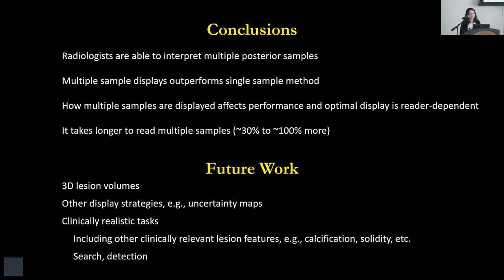We also plan to expand the study to more clinically realistic tasks. In addition to spiculation, there are other lung lesion features that are important for diagnosis, like calcification and solidity. We also plan to expand the study to include elements of search and detection.